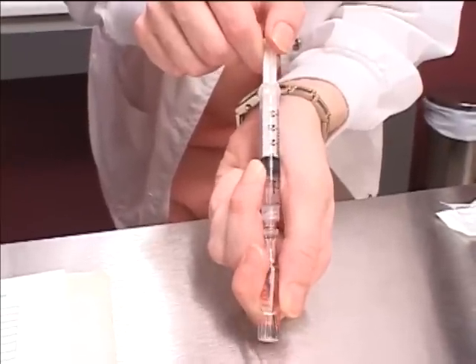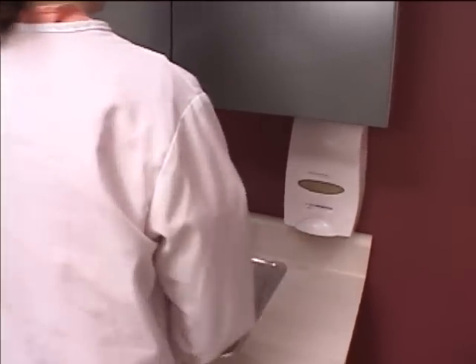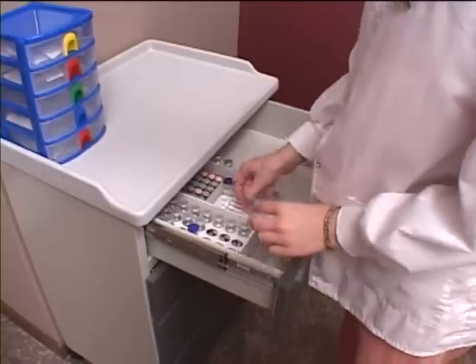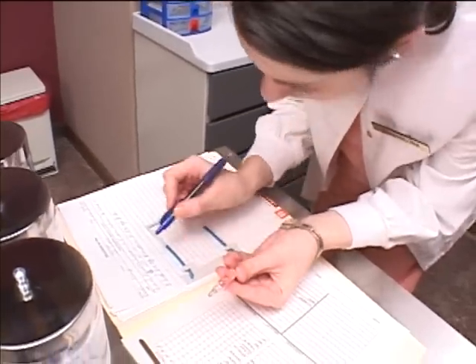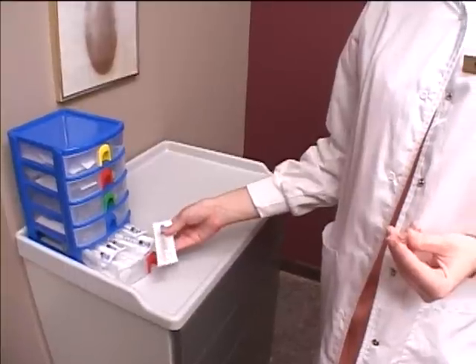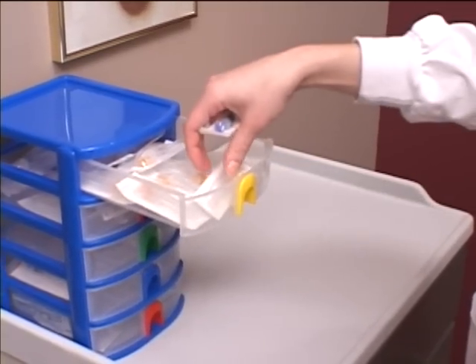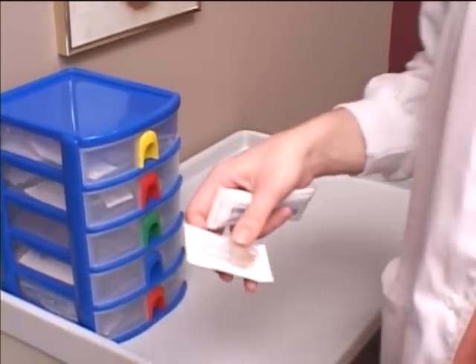When ordered to withdraw medication from an ampule for administration, you should begin by washing your hands. Check the physician's order. Select the appropriate ampule and prevent error by verifying it against the physician's order for the 6 rights. Determine the route the medication will be delivered to ascertain what size syringe and needle will be needed. Then select a filter needle that will trap any glass fragments when withdrawing the medication from the glass ampule.